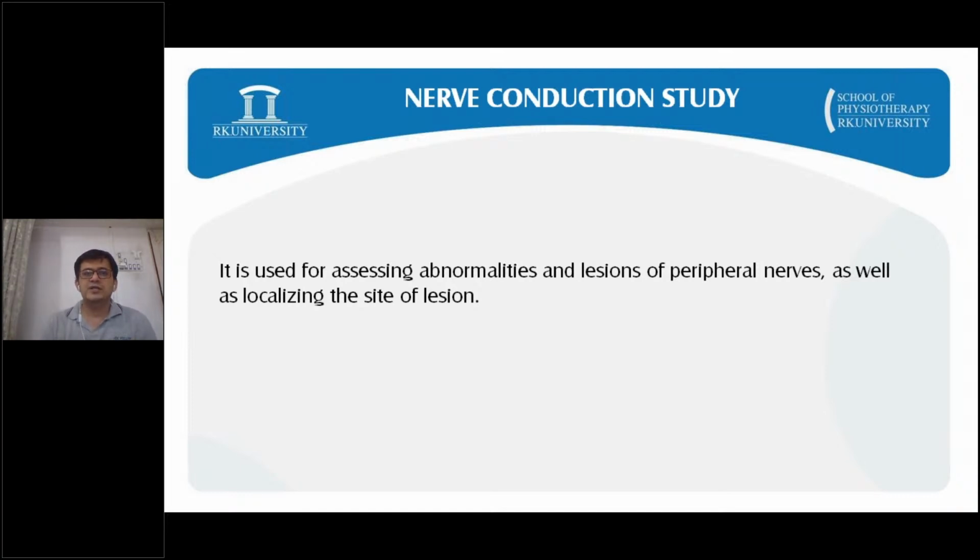Nerve conduction study will be used for assessment of the peripheral nervous system. It is purely for the peripheral nervous system. Clear? There were two limitations, if you remember, for the SD curve. The SD curve gives us qualitative data. It is not giving us quantitative data. Like if you say that the muscle is having partial reaction of degeneration, it is not telling how many fibers are denervated, like 42%, 45%. It is not possible to quantify. It is just giving you qualitative data.